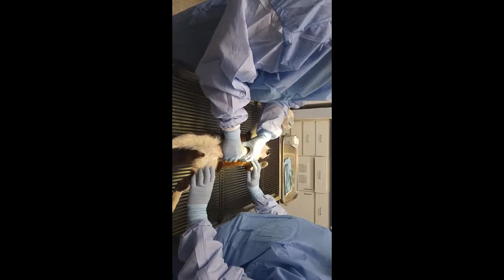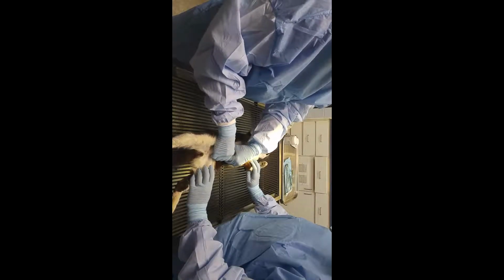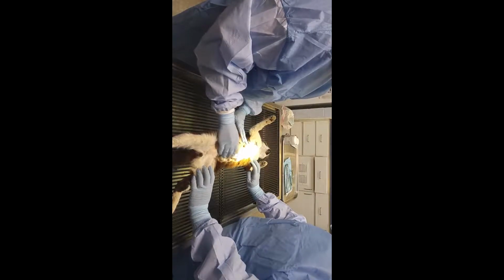Just palpating and kind of feeling inside of her abdomen, her intestinal loops feel very, very thickened and ropey. So we'll definitely want to pay attention to that when we get inside.